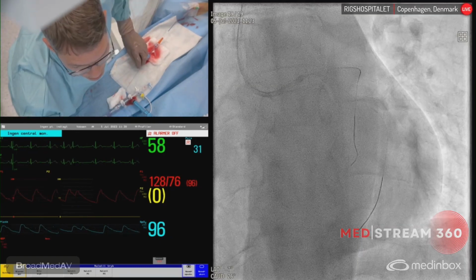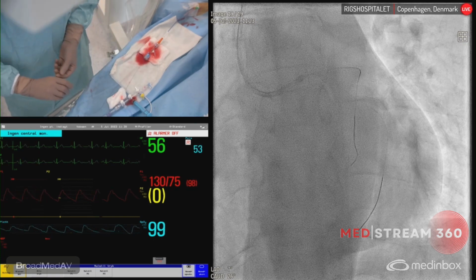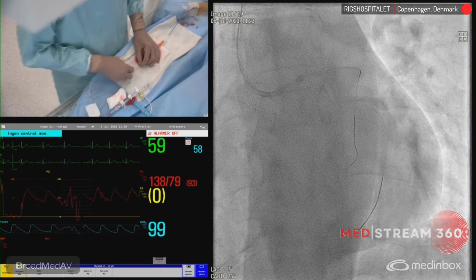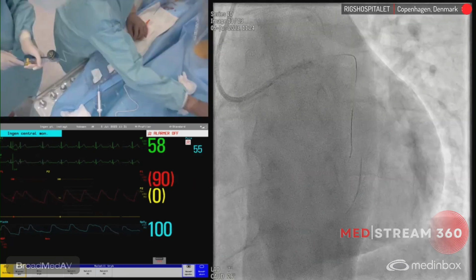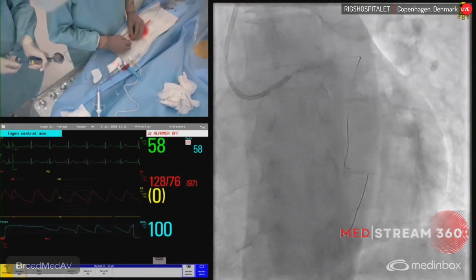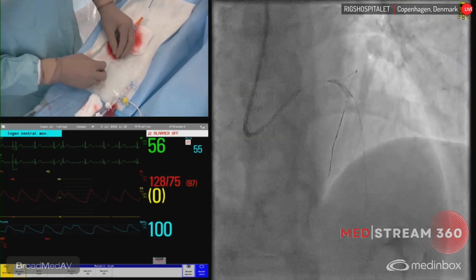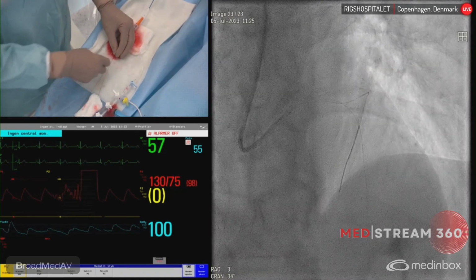And we have seen on the IVUS that we probably need a stent around 25 millimeters. We go for a Megatron because that one can be dilated from 4.0 up to 6 millimeters. Probably 5.5 in the left main. What you see on the screen now is just a 4.0 non-compliant balloon. This is just where we plan to POT afterwards. I slide a little bit. I think with a long stent, it will keep in place. And as you can see on the screen, despite multiple dilatations in the left main, pressure remains stable. And the patient, as we said earlier, has a normal left ventricular function. So that's why there's no hemodynamic compromise with these dilatations.